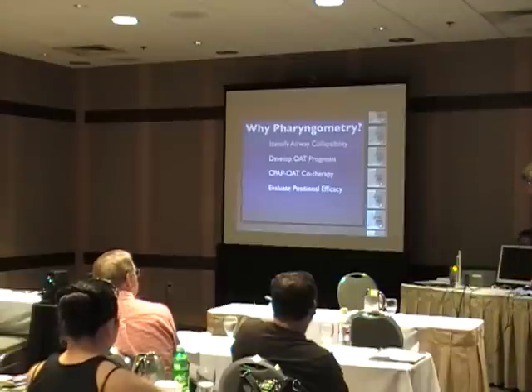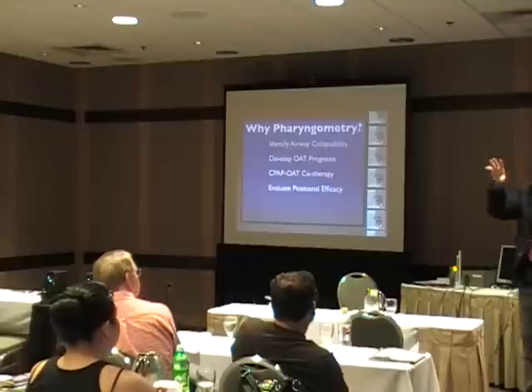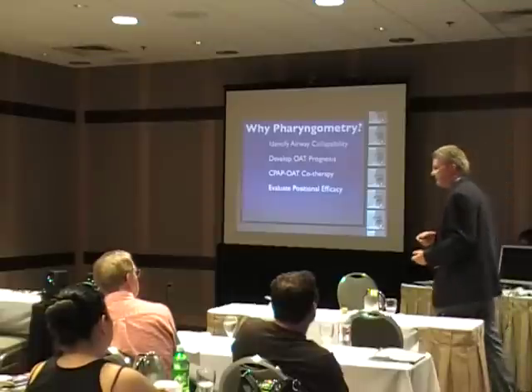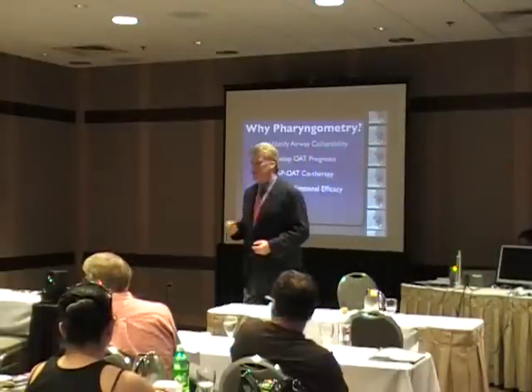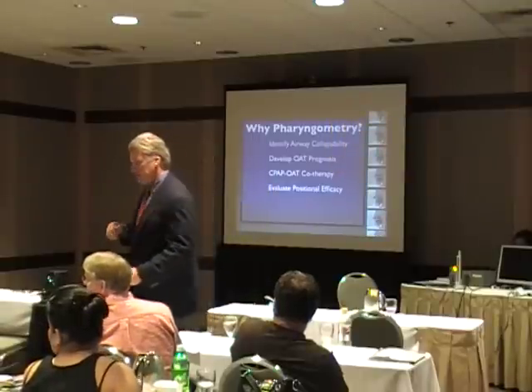Showed you these little jigs, and these are really brilliant, okay? You can use different jigs, different sizes, and do different pharyngometric tests to see which vertical dimension might help the patient. Okay, maybe we need to add 2 millimeters, like where's that purse? Where's that appliance? Right there. Okay, I love this appliance because, just throw it, that's the Henry one there.